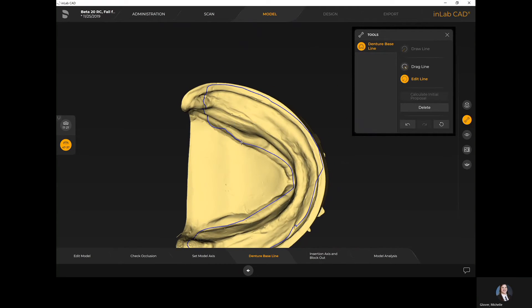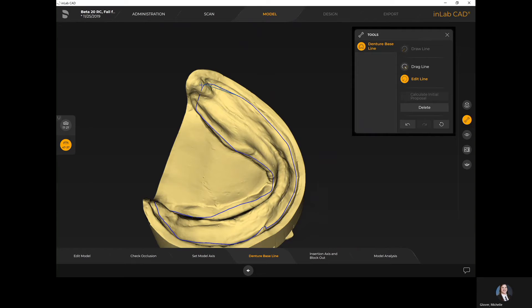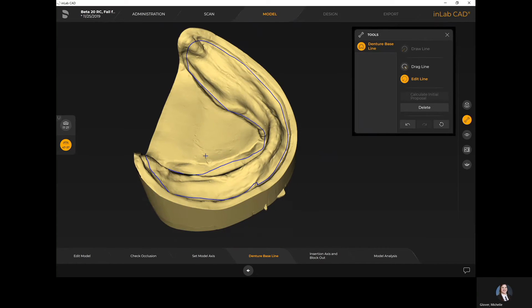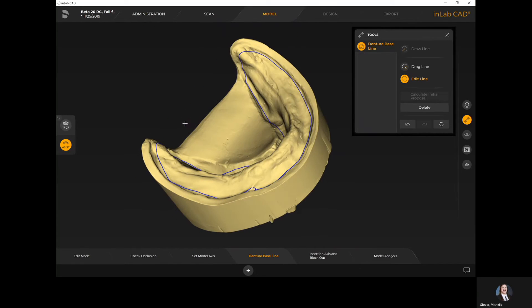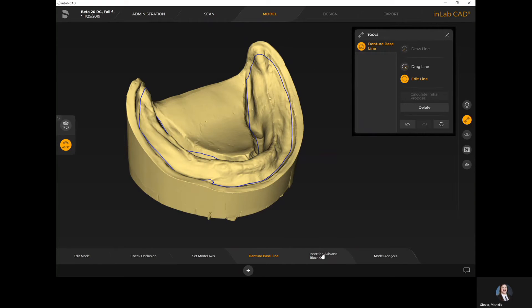Once you're happy with the border you can move forward. You can always go back and edit this step after the initial proposal — if you can't tell at this point where your border should fit, that's not a problem; you'll be able to go back and adjust it. You just need to give an initial proposal to the software so it knows its starting point. If you need to quickly tweak this portion after designing, you can jump back into the model stage to do so.